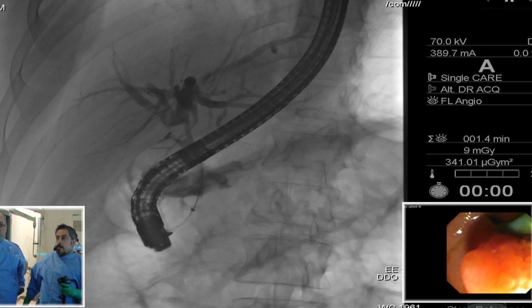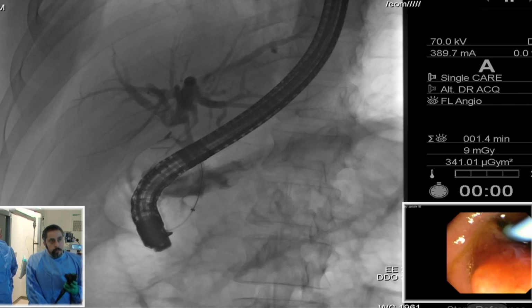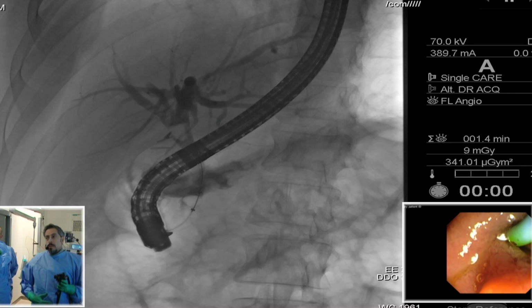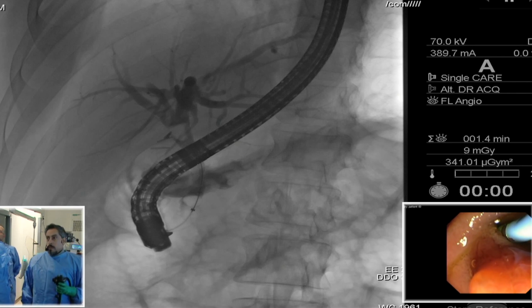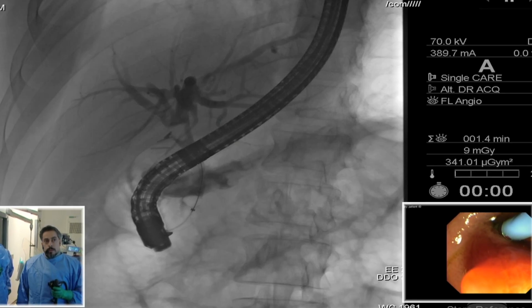Okay, so we were discussing the best modality for this patient. As you see in the cholangiogram, this stone is impacted in the common hepatic duct with a distal long segment stricture or narrowing of the CBD, maybe inflammatory stricture from multiple trials of stone extraction. And this patient has also had at least 3 trials of failed endoscopic ERCP extraction.